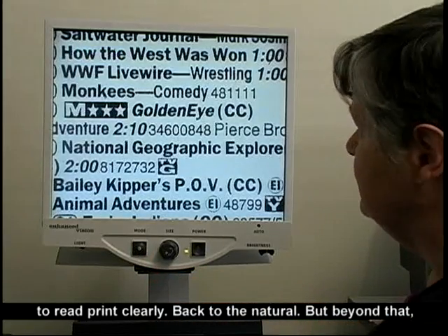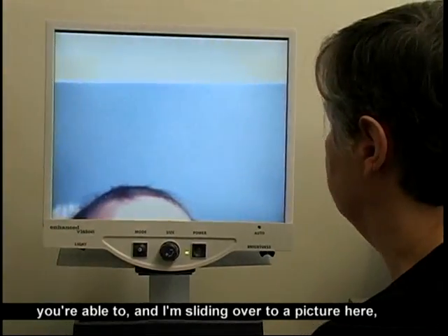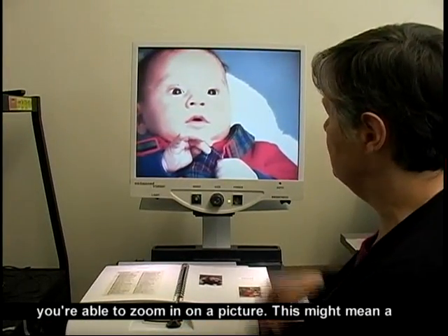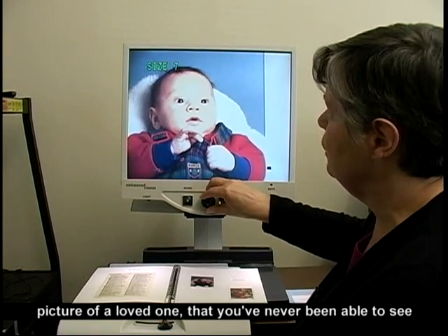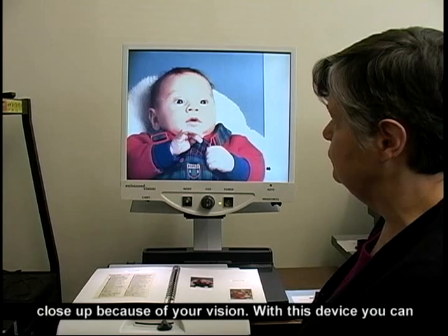Back to the natural. But beyond that, I'm sliding over to a picture here — you're able to zoom in on a picture. This might mean a picture of a loved one that you've never been able to see close up because of your vision.